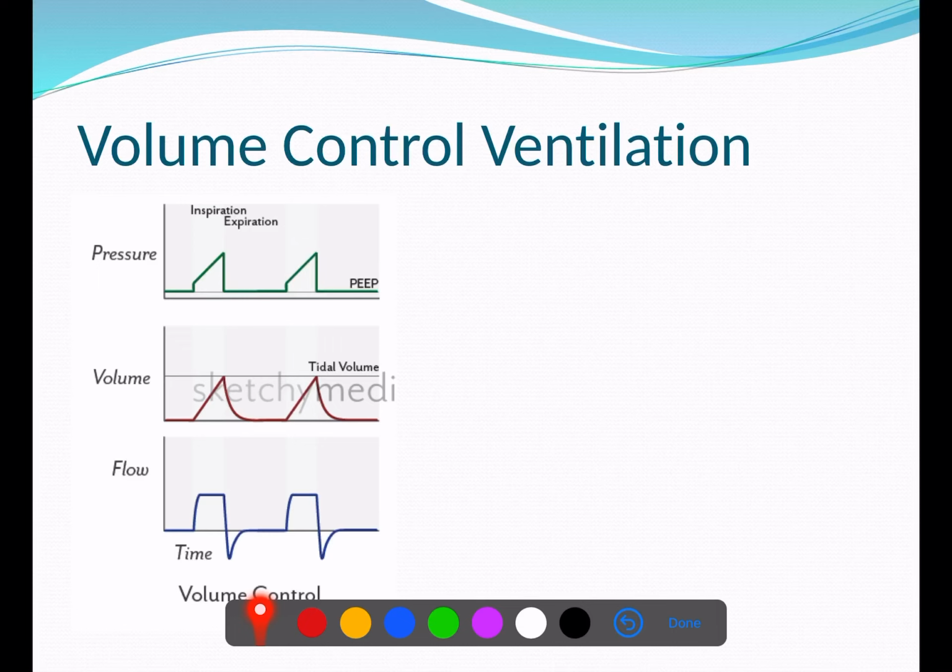Now, when we look at the different curves that you see on a ventilator, I always teach that there should be 2 curves on the screen at all times. The pressure time and the volume time graph, I'm not actually that bothered about. Of course, when I'm doing complex ventilation, I want to see those, but for every single person, you must have 2 graphs on the screen at all times.